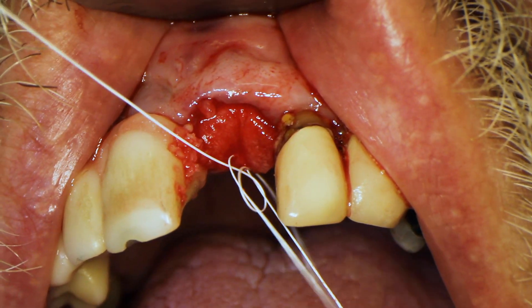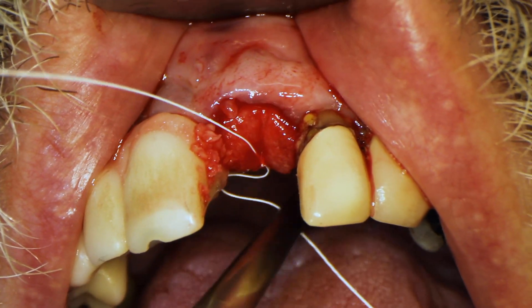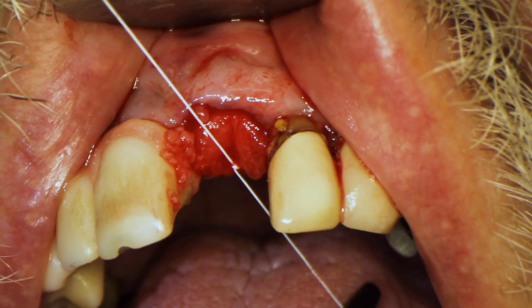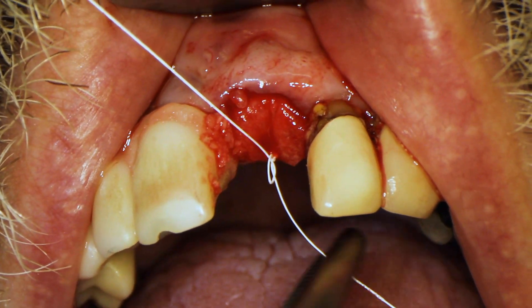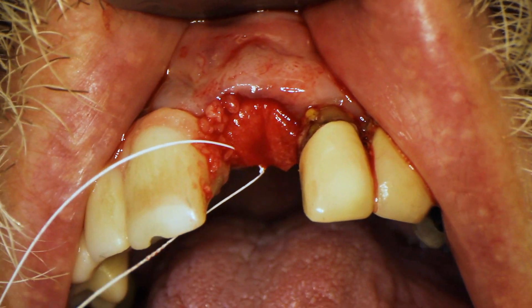I'm going double one way, double the other way — a regular surgeon's knot. You can leave it like that, or you can do another suture, like a figure-X over it, or interrupted going diagonally one way and then interrupted going diagonally the other way. That should hold it in place nicely.